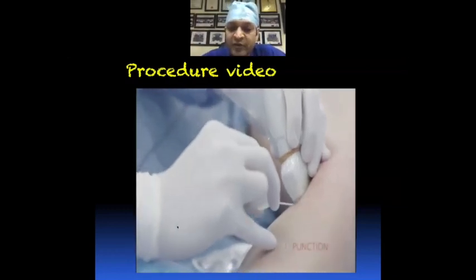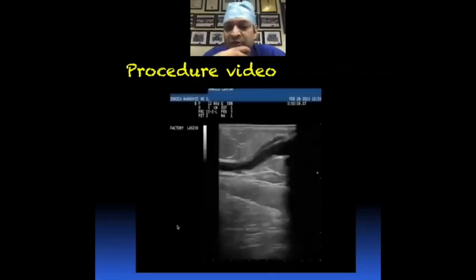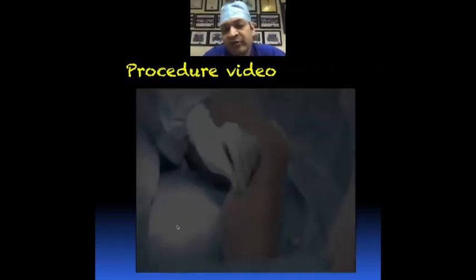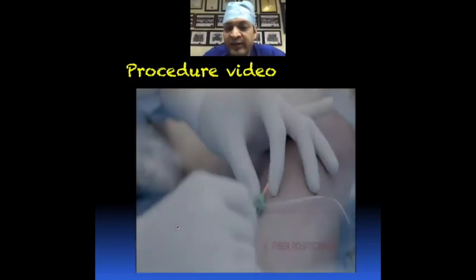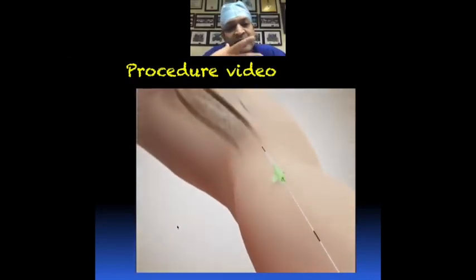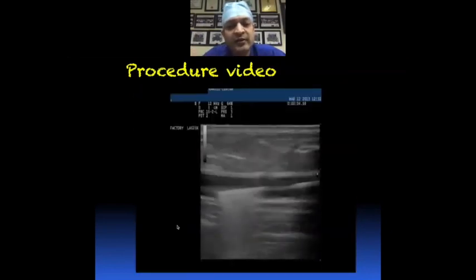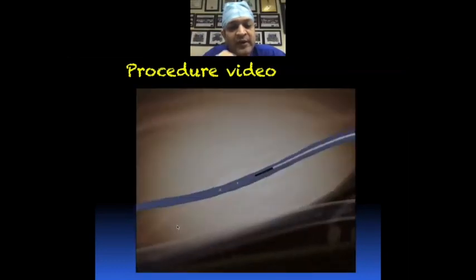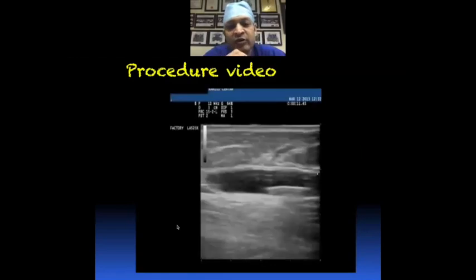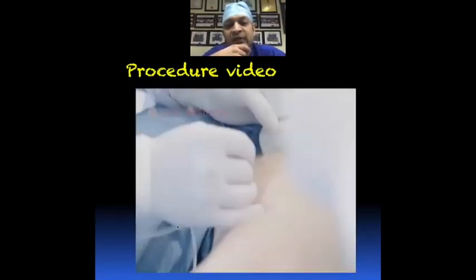It's not my video, it's a company video, but it was very nicely made, so I've just taken it to demonstrate. It's a nice ultrasound video. You can see a 6 French sheath, a green sheath, and you put in a radial fiber. You can see it very nicely illuminated, and there's an animation along with it. Into the long saphenous vein, you gently take it. You can see the fiber; the black color is the vein. You slide the fiber along the vein as you see it on the ultrasound simultaneously on the side, and you place it at SFJ.